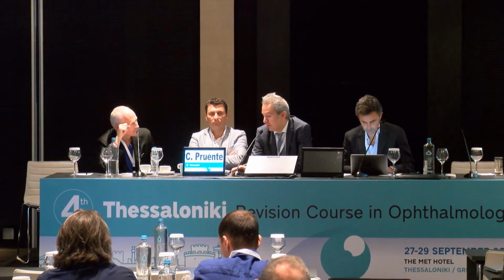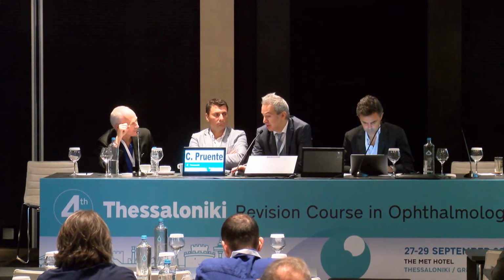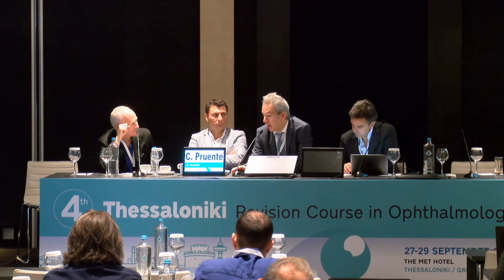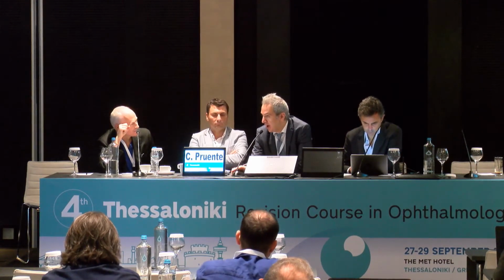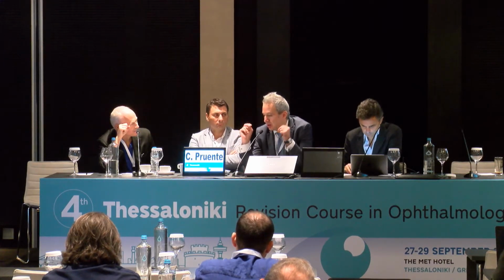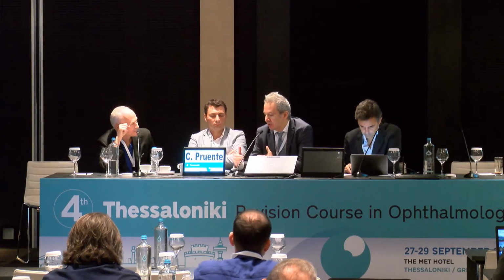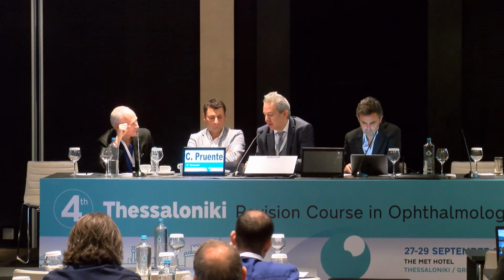We also see patients, I've seen patients where I could only treat about 20% of the coma, and there was very minimal increase in visual acuity, even though I'm a big fan of this procedure. So how can we explain the failure of the visual outcome in patients where we don't have a full treatment range, where we can only correct a certain amount of the aberration error, because we just see and adjust our ablation depth based on the refraction of the patient.